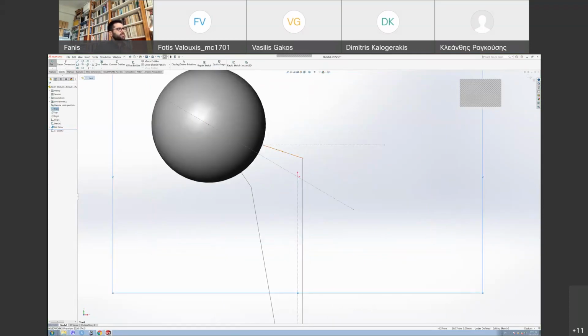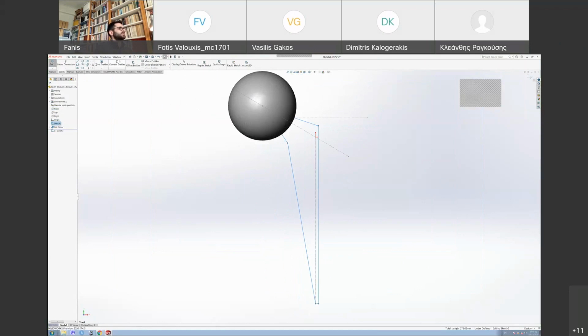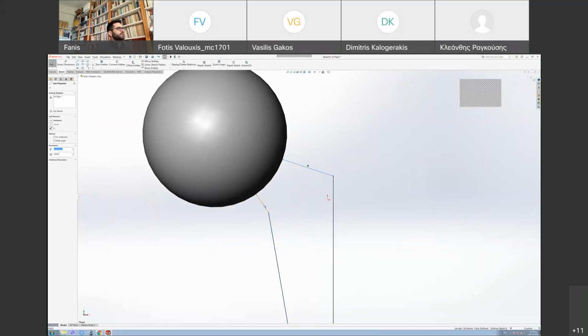Now again, in order not to design all these things again, you can just choose these lines. Okay. You can say convert entities, so it brings it to your sketch. So even if I hide the sketch, for example, now I still have these lines in my sketch, which is pretty helpful. And now I will convert these lines for construction, and I will explain why. If I just connected these lines here, then I will end up with a very weird looking solid, because there will be gaps between this surface of the solid and the sphere. In order to make sure there are no gaps, I'm just gonna go and extend these lines to go well into the sphere.